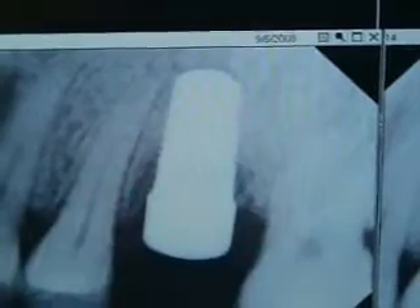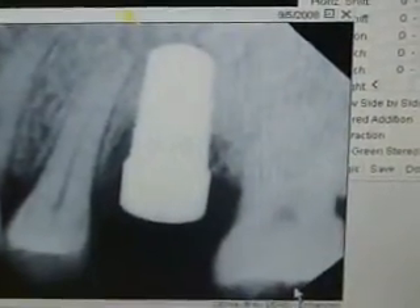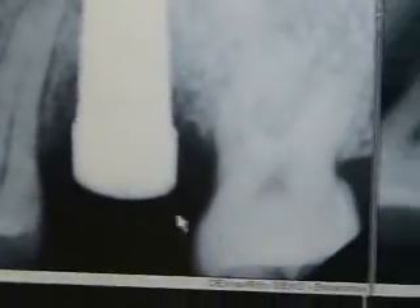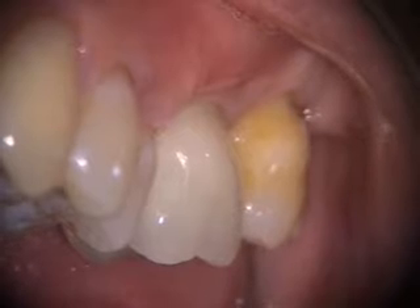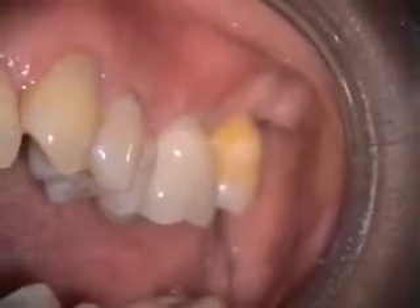Take a look at the x-ray. So there's our pre-op healing of the extraction socket, and then here's our implant — a 5.7 Implant Direct with a 6.5 by 5 healing abutment. This is the implant right after we placed it, and this is the implant today, about six weeks or so. Here on the mesial it looks a little less dense, but it's kind of more on the video side because there's plenty of bone there. This is the final restoration on the implant in the 14 area.